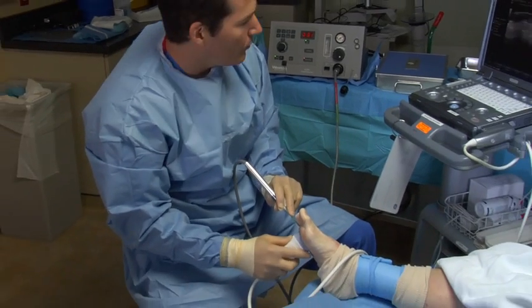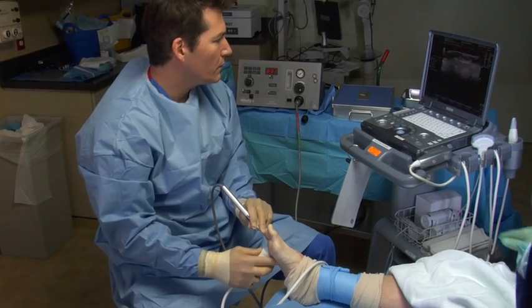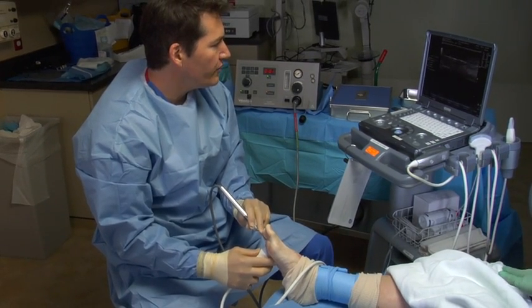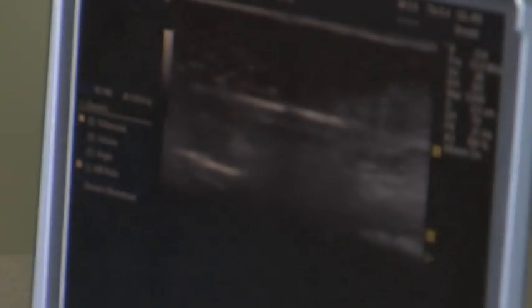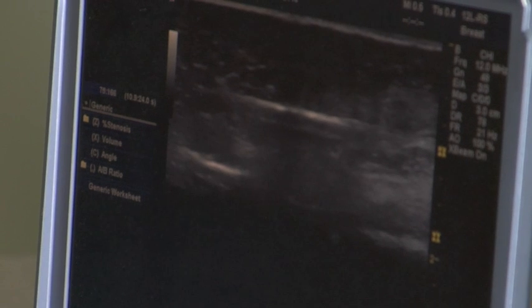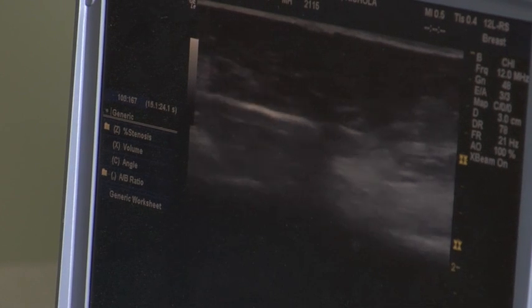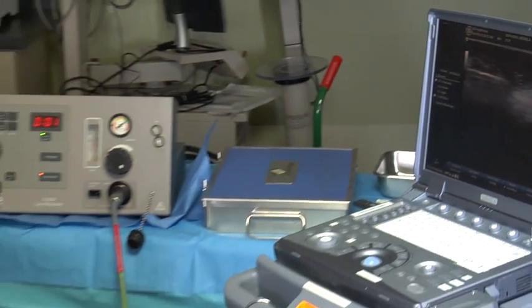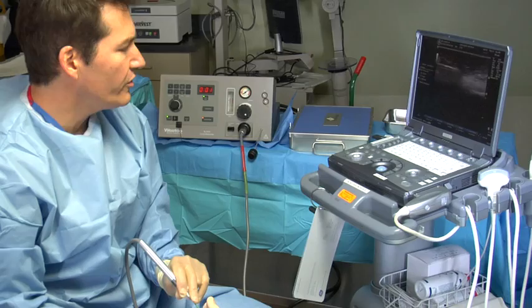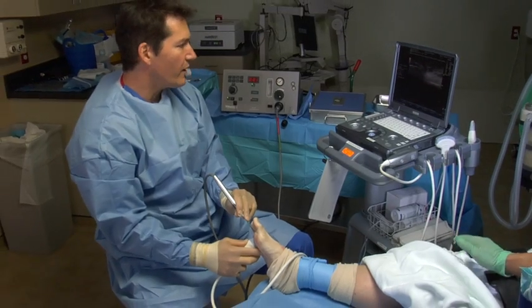And just check my probe placement. Bill, if you can hit the freeze button. There we go. I can see right there my probe very clearly. And I can see where the nerve is. I can see exactly where I need to put the probe in order to be right on the nerve. A very useful tool. Right now, the tip of the ice ball is right next to the nerve, so I know I'm in a good position. I'm going to go ahead and let the pedal off, and we're going to do a 2-minute and 30-second freeze.